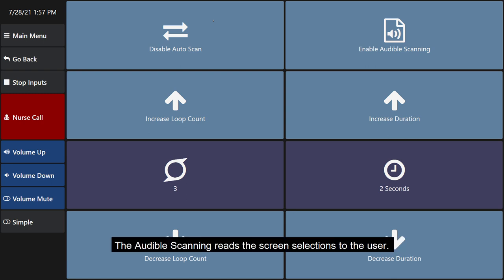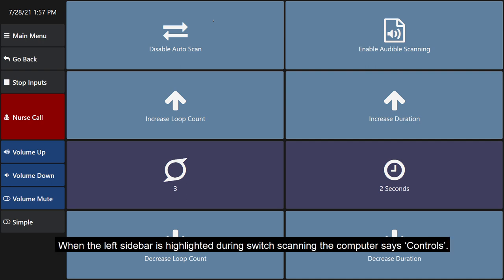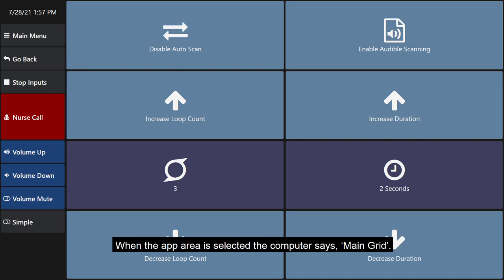The audible scanning reads the screen selections to the user. When the left sidebar is highlighted during switch scanning, the computer says Controls. When the app area is selected, the computer says Main Grid.